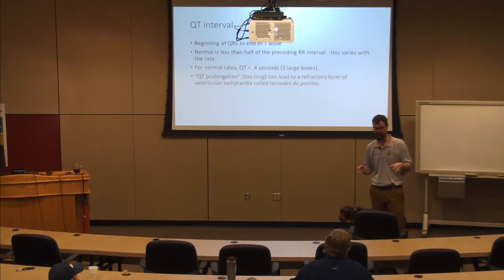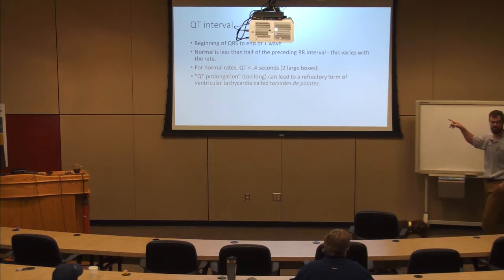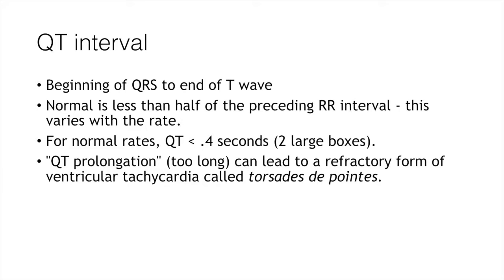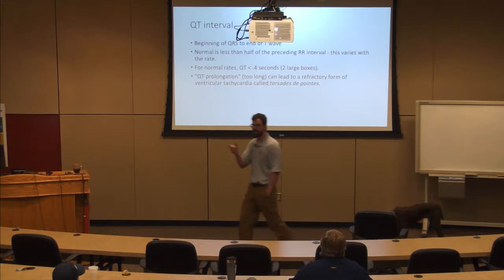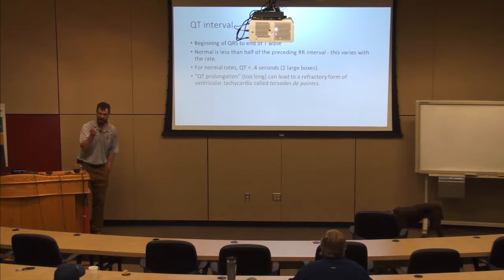But you find them in the same house at the same time, right? So it's kind of the same with QT prolongation and wide QRSs in the setting of overdose and toxicity, okay? They both have cardiotoxic effect. They work by different mechanisms. Frequently, they'll be hanging out at the same time, okay? And be cognizant of both of them.